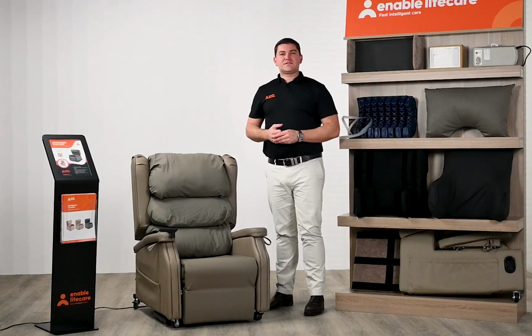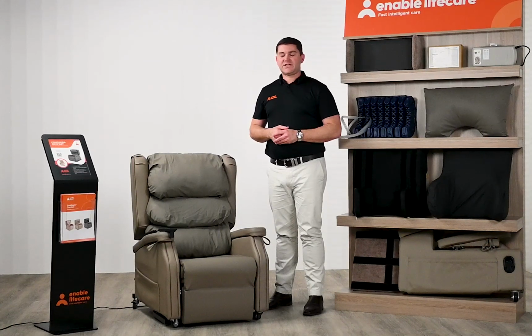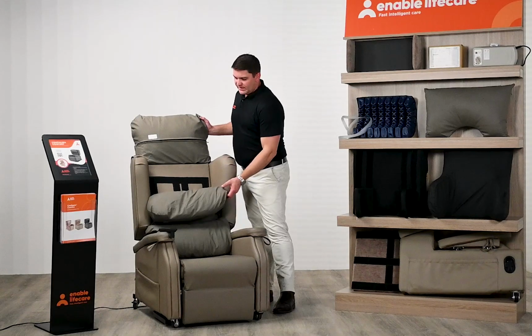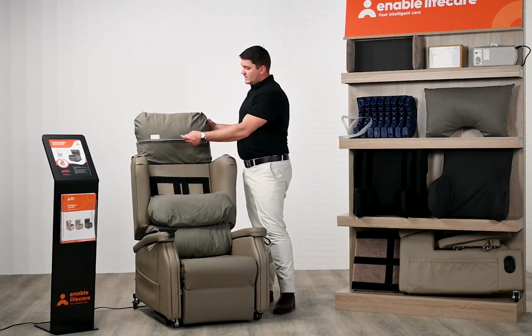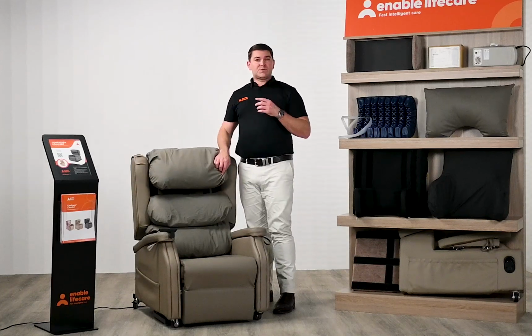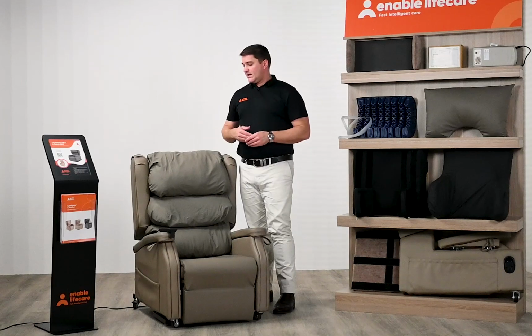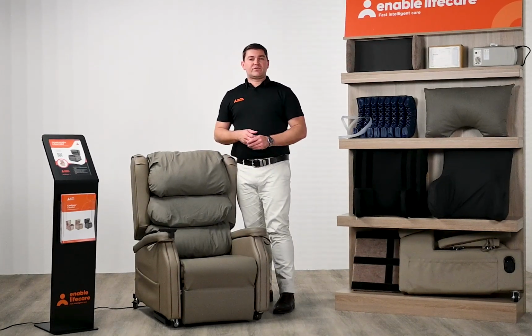In this video, we're going to look at some of the posture options that are available for the Configura Comfort chair. So as standard, what we do have the ability to do with the existing pillows is to play around with the stuffing inside. There's a zipper at the back of the pillow, which we can use to gain access to the back of the pillow. And what we can do there is we can remove stuffing, add stuffing, and move stuffing to provide additional support as required.